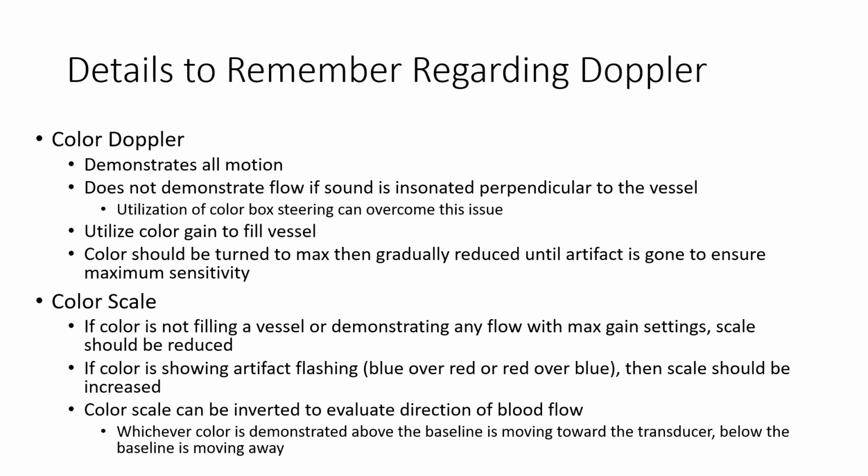So don't be afraid to steer your color box. Make sure you remember to do that. If you don't have a color box steering, or you can't utilize it for some reason, know that if you just get your vessel angled across your screen, you can accomplish the same sort of improvement in visualization of color flow.